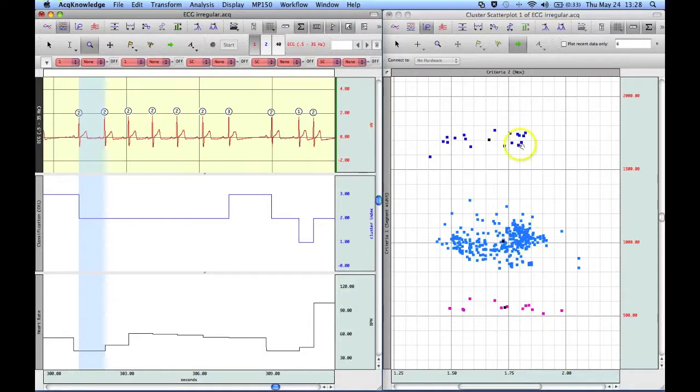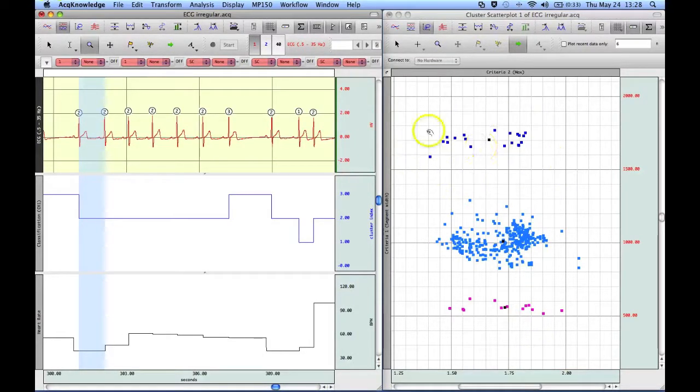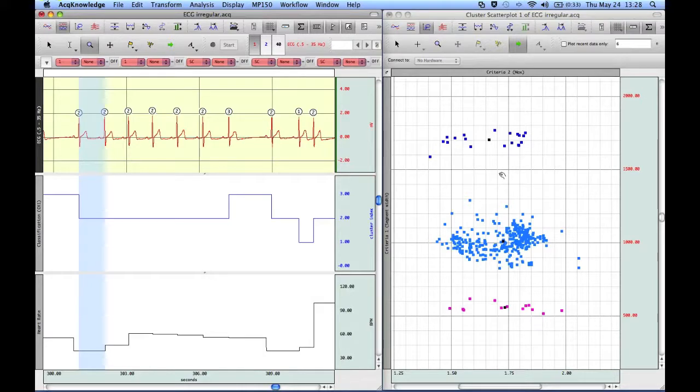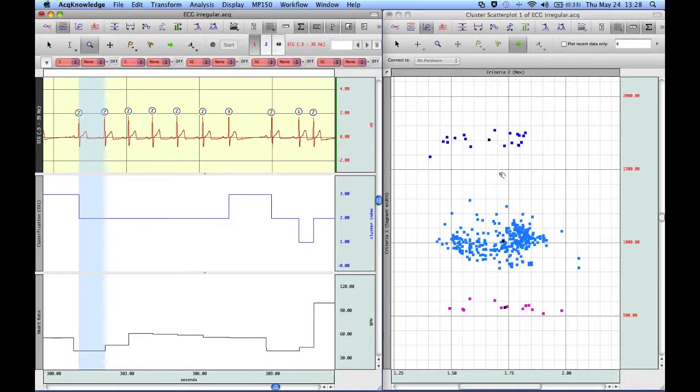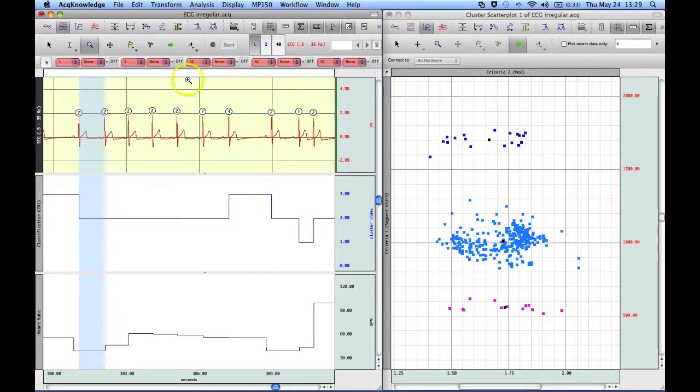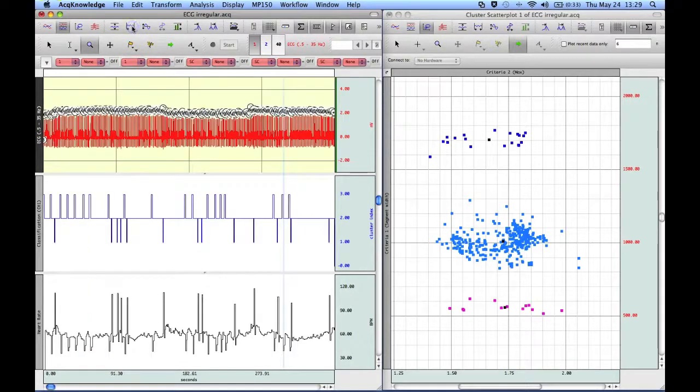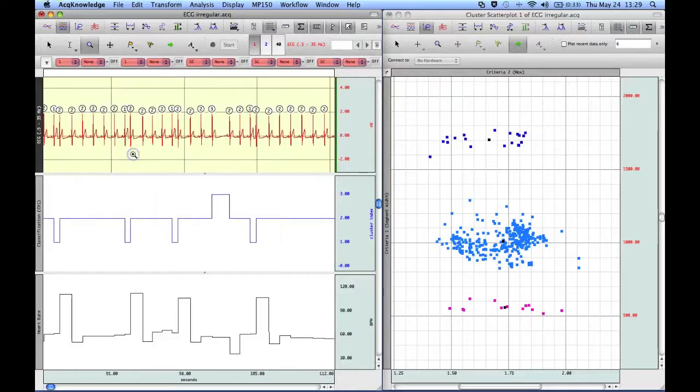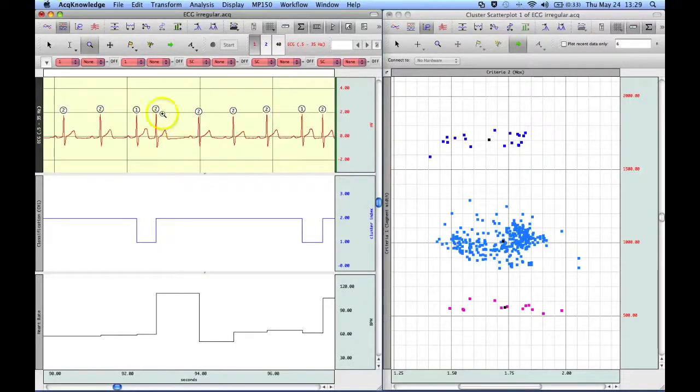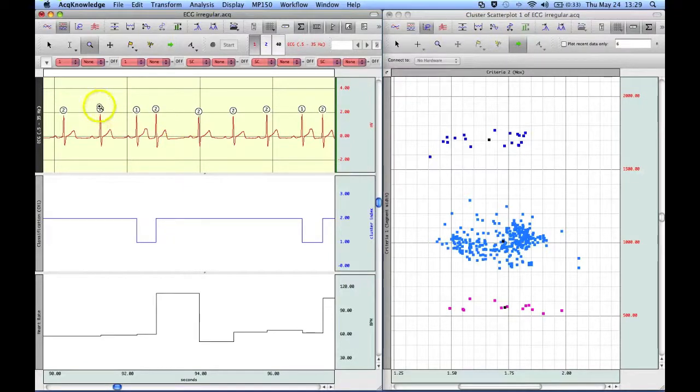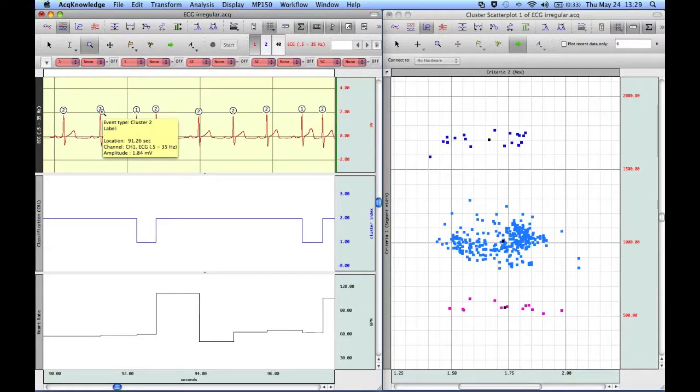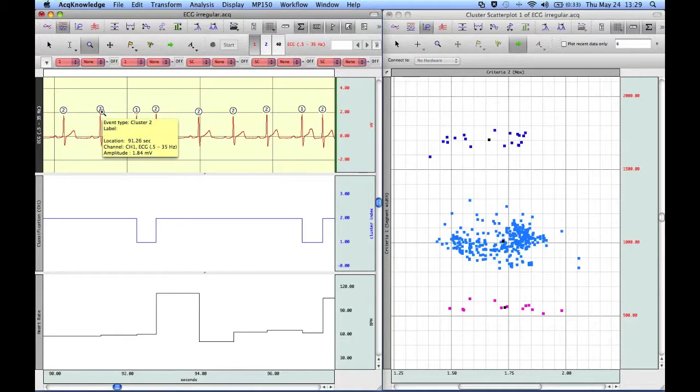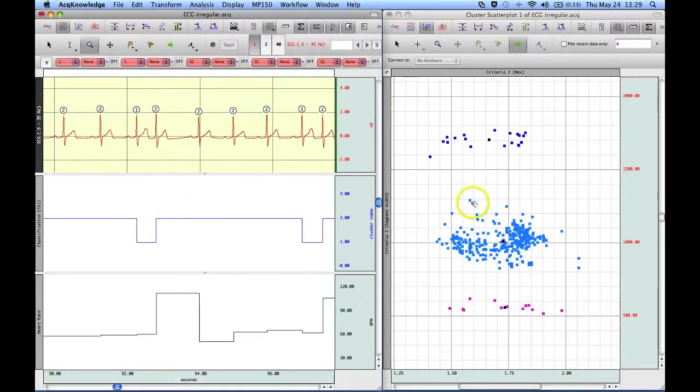So this is how the software has determined our ECG waveforms fall based on the criteria that we used, which was the segment width. So in other words, from one peak to the next and the amplitude of the R wave. And then back over here, we then have this graphed out as a new channel. Now, of course, using the fine cycle peak detector, it's also possible to use the peak detector to locate all the group one, group two and group three for further analysis. But this is just a very convenient way of being able to identify the different groups within your data set.